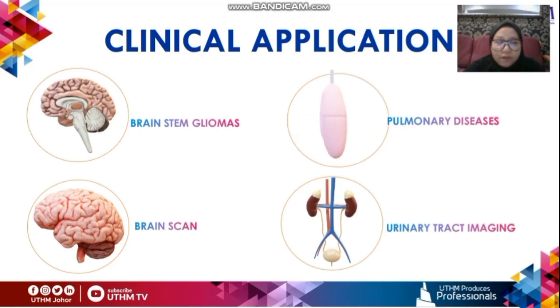Next, for pulmonary disease, on CT scan, normal lung tissue has a dark appearance, however not quite as dark as the air that is contained within the lungs. When a local lesion or nodule is seen on a planar X-ray, a CT scan is often carried out as a follow-up procedure. A CT scan may provide a much clearer picture of the lesion size, shape, uptake of the injected iodinated contrast agent, and calcification status.